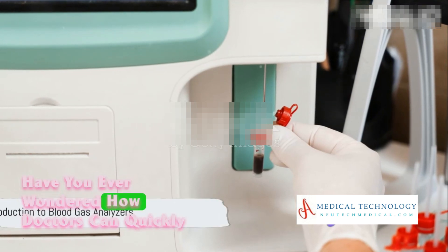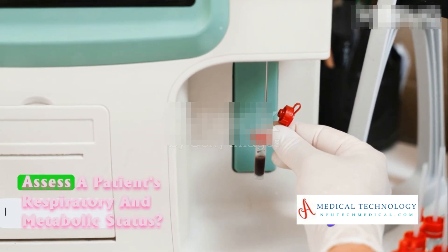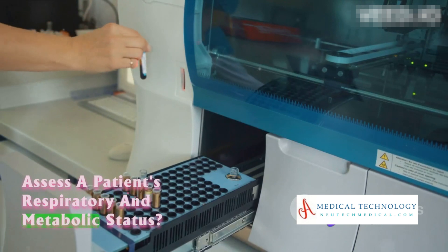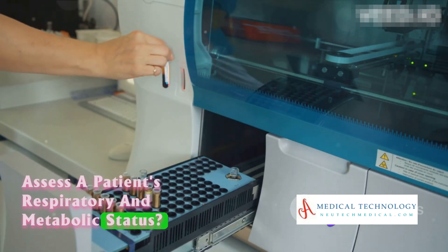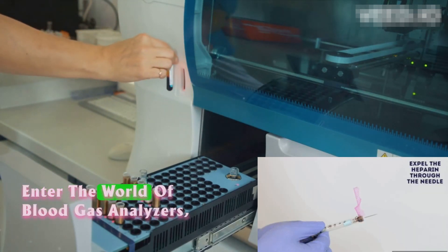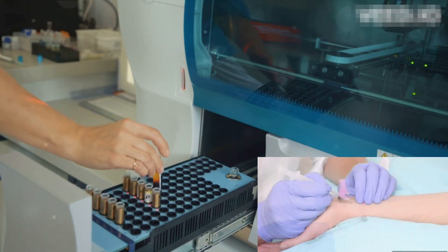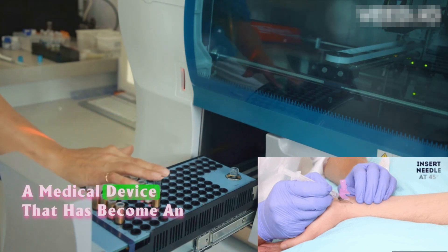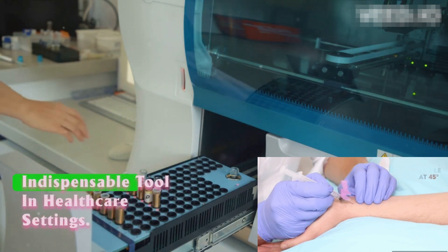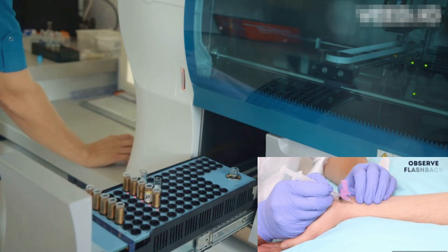Have you ever wondered how doctors can quickly assess a patient's respiratory and metabolic status? Enter the world of blood gas analyzers, a medical device that has become an indispensable tool in healthcare settings.